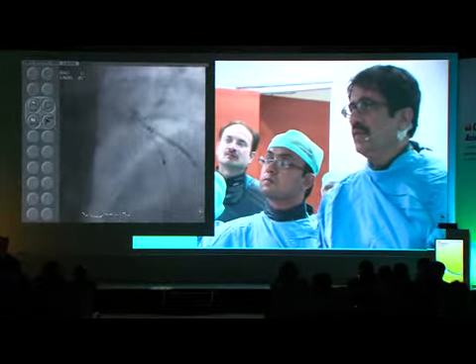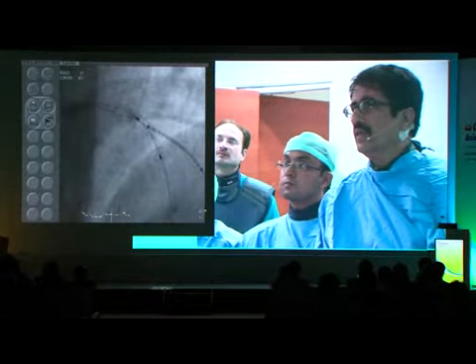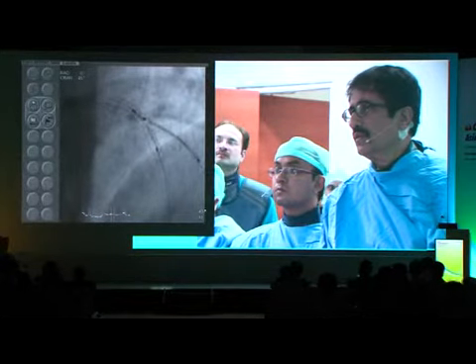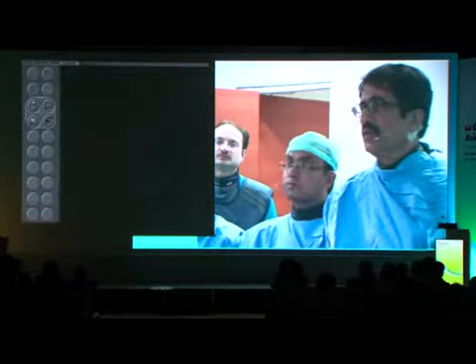Is it that your stent is slipping away? Because the distance between the proximal marker and stent is much more compared to the distal marker and stent. I'm talking about the diagonal stent. It's difficult to judge where the proximal end of the second stent is. You should choose one stent for the diagonal with a marker exactly coinciding with the stent itself, because there's a lot of gap between the marker and the stent.